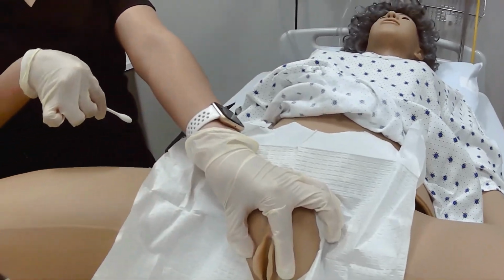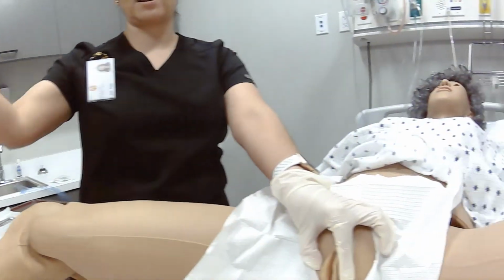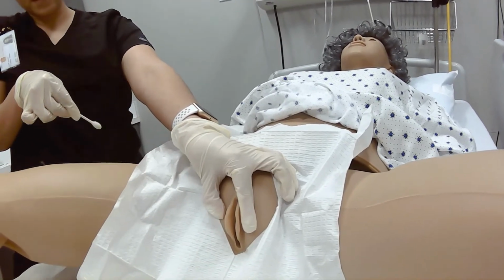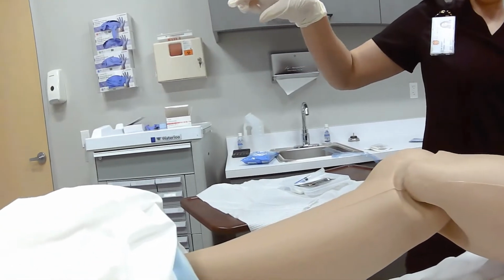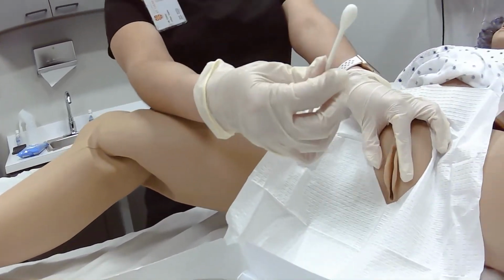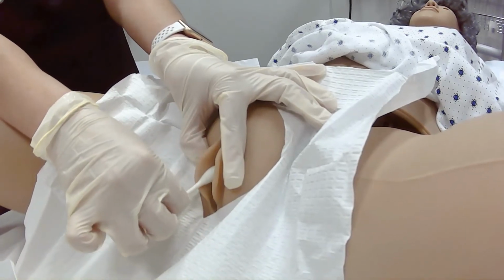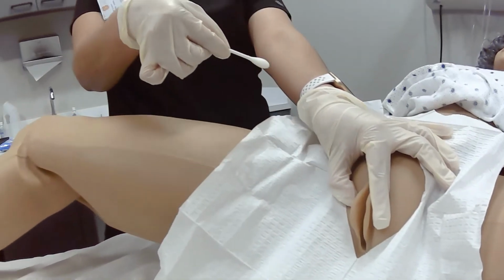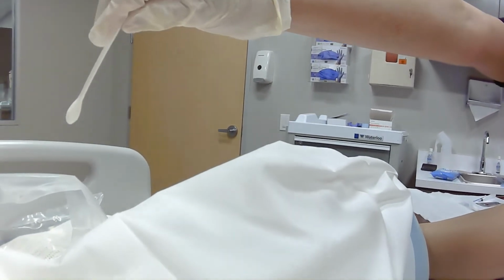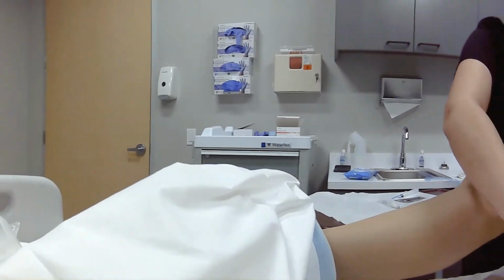And when you have to come across, do it around the leg so that way you're not contaminating across your sterile field. Okay, that's a big no-no. So top to bottom, and then once you're done, you're going to come around and throw that away. So we're going to get our second swab stick, and now we're going to clean top to bottom proximal. Okay, so top to bottom proximally, one wipe, coming around. And again, if you have your little trash bag that you made with the packaging, you can throw it there, just making sure that you're not contaminating.